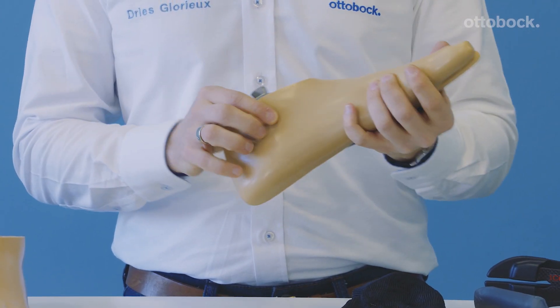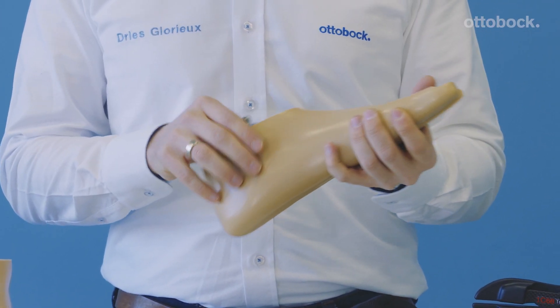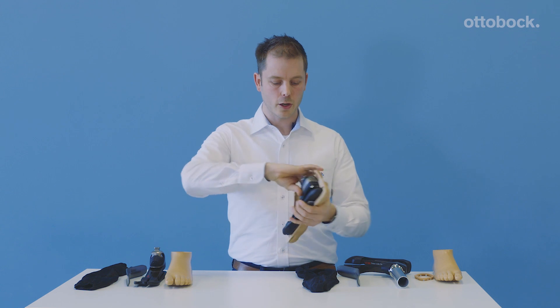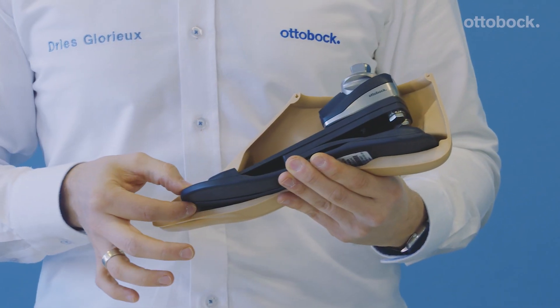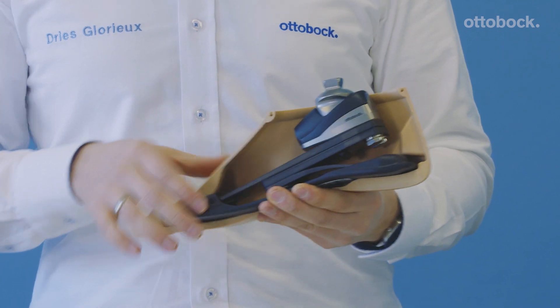As you can see, thanks to smart engineering, the complete unit is integrated in a footshell. If you turn it around, you can see the inside. Here you can see the heel correctly mounted and the toes correctly mounted. That's really important for the functionality.